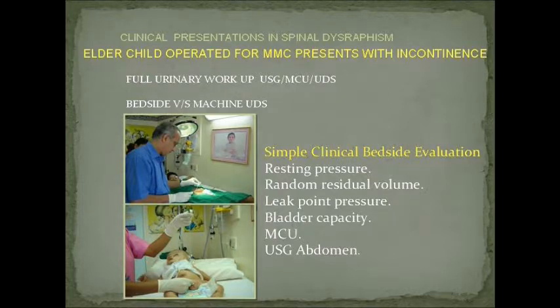We are getting more and more scientific, but a significant bit of urodynamics is art. So your experience, your evaluation, and your history taking are equally important.